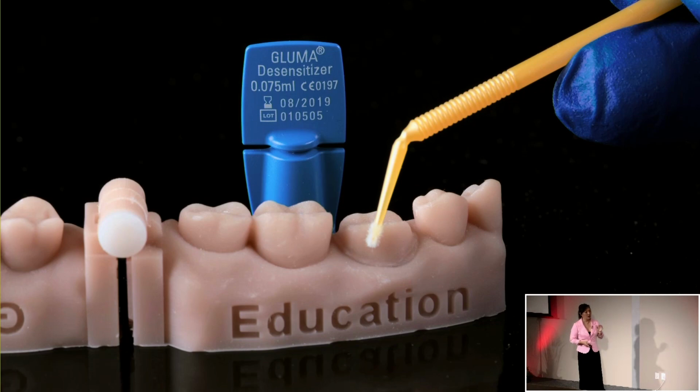And then I like to take this opportunity to desensitize the tooth. There are products out there, Gluma, G5. These all have a special ingredient called glutaraldehyde with HEMA that's going to help plug up those dentinal tubules that are exposed during dental treatment. Maybe you might have over-dried it. Maybe the acid etch was just too much. This is your opportunity to desensitize. I use this in my cementation protocol for everything that I do.